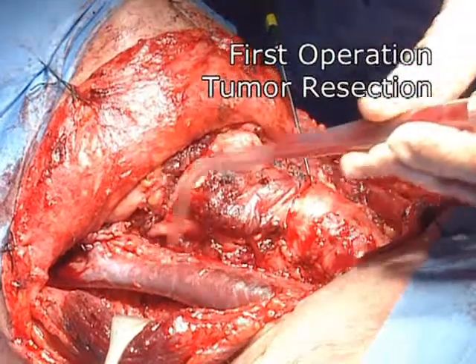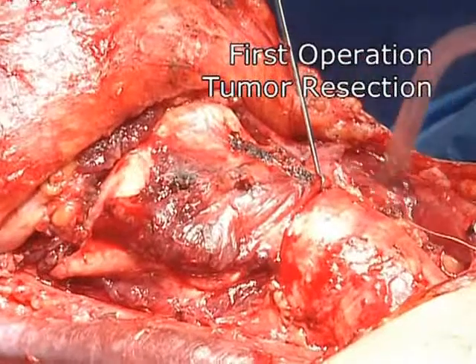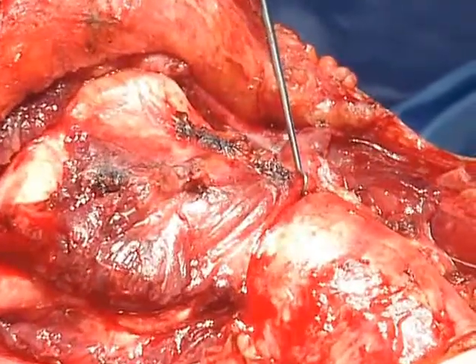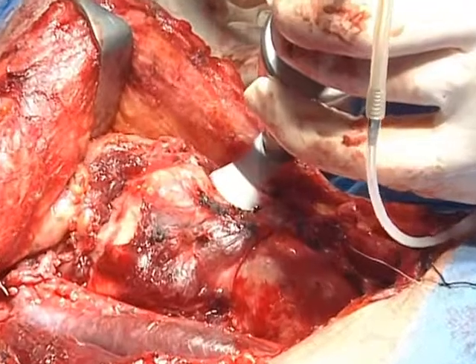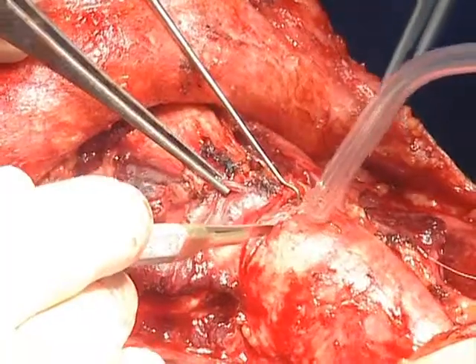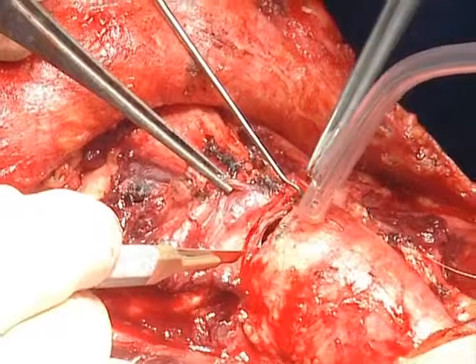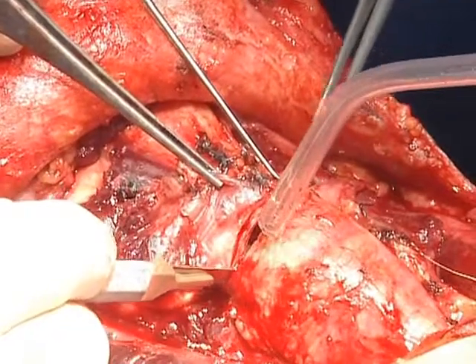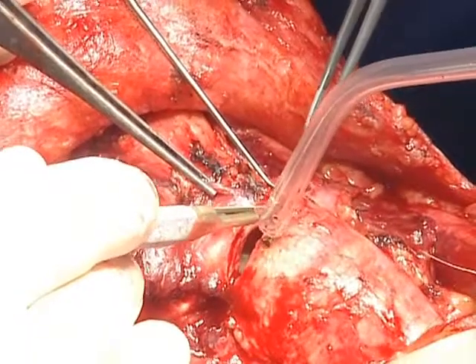After neck dissection, the larynx is incised anteriorly with inclusion of one centimeter of the contralateral side. The cartilage cut is made with an oscillating saw. The cricotracheal ligament is incised at the tumor side and the intubation tube is placed in this incision.